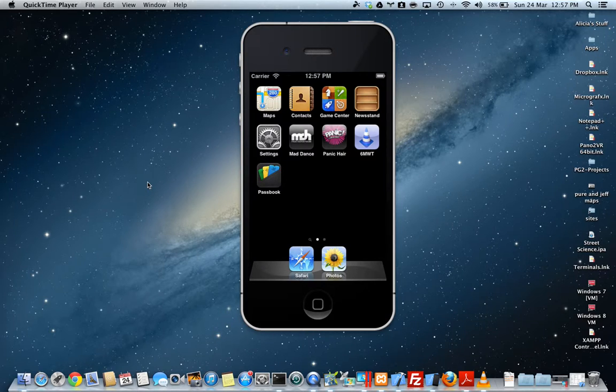Neil here, just going to show you the new 6-minute walk test upgrades.